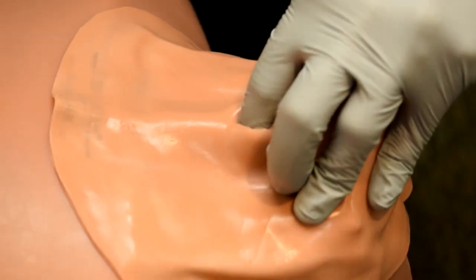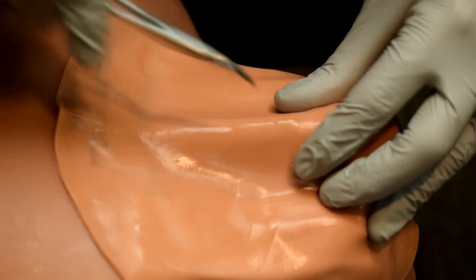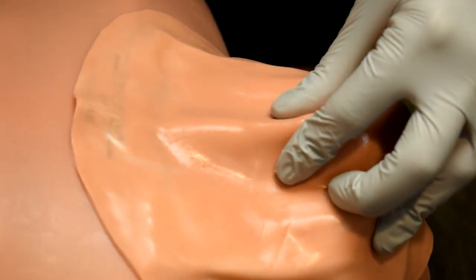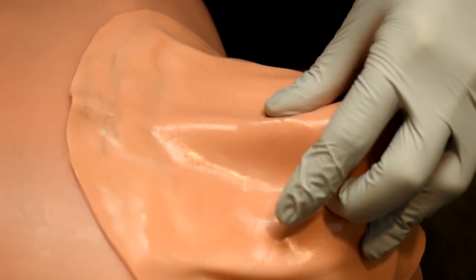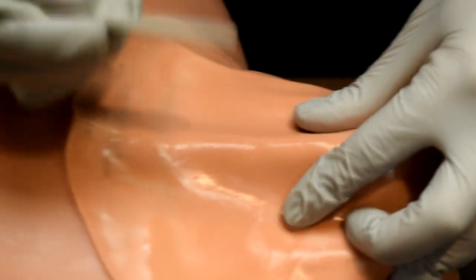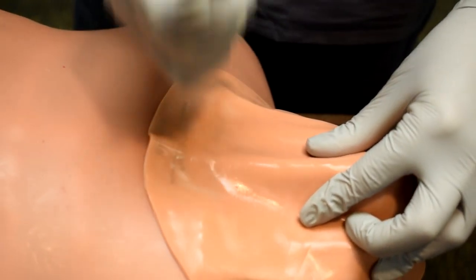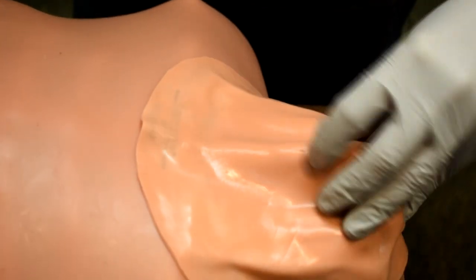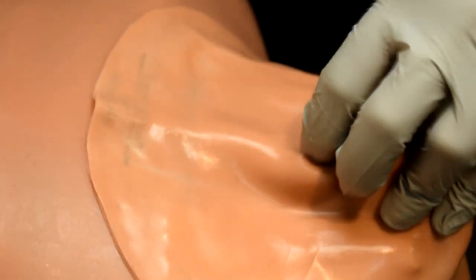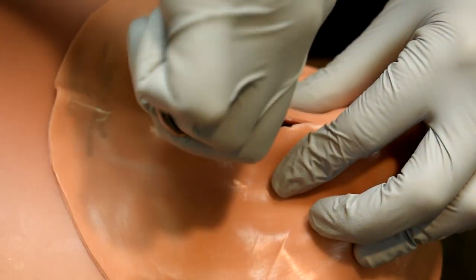I can dilate with my finger, or I can dilate with a clamp and stick that in and dilate. What you do not want to do is dilate with the back of your knife handle. If you turn your knife handle around and dilate with the knife handle, you are at risk of cutting yourself. Please do not do that. So you can either dilate with a finger, with your pinky finger, with any finger you have, or if you have a clamp available, you can stick a clamp in and dilate.